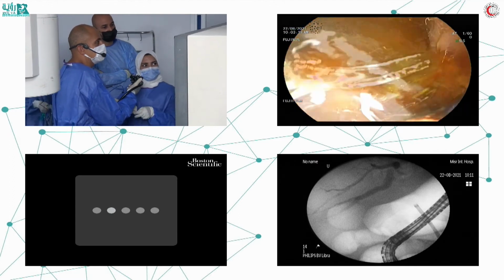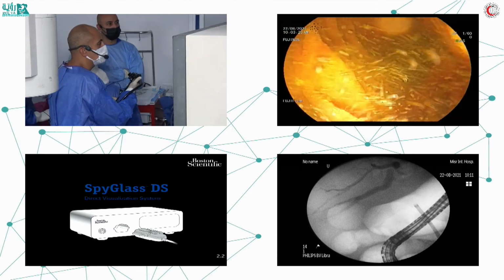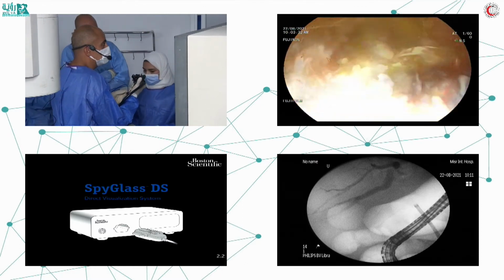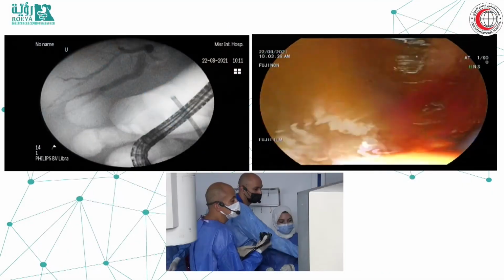and then after that, could you shift to the endoscopic view? Yes. So now I will put a spy bite, and my target is to target this area with vessels, with a little bit of atypical mucosa and vessels, and then after that, Mustafa, yes.